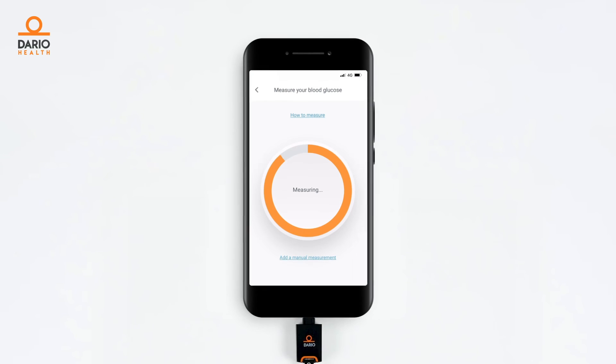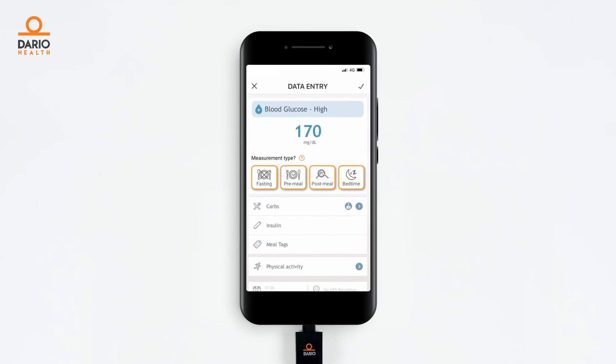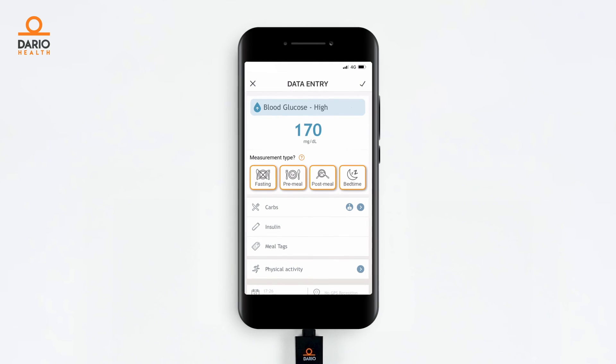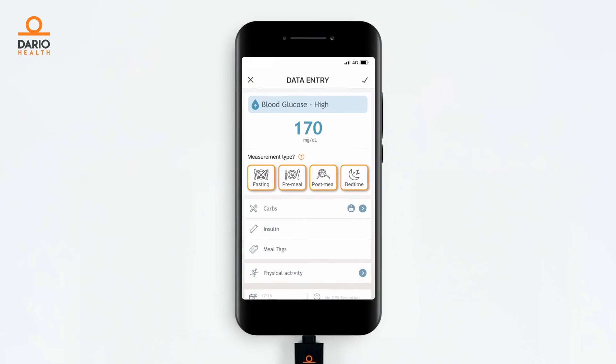After six seconds, you will see your blood sugar measurement result on the screen. The screen will revert to the data entry screen, and your result is saved automatically. You can input other information such as your food or carb intake, insulin, or physical activity, as well as tagging pre-meal, post-meal, and more.